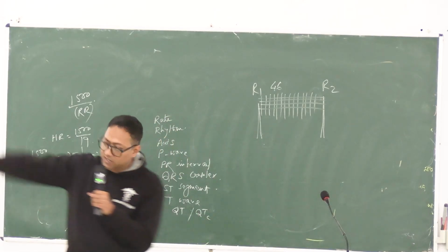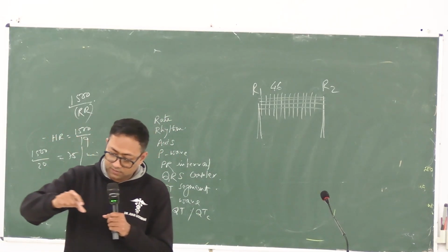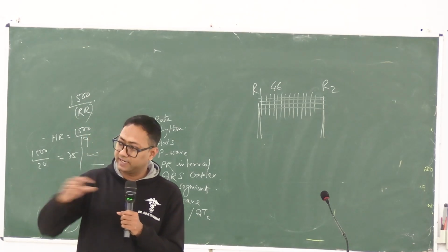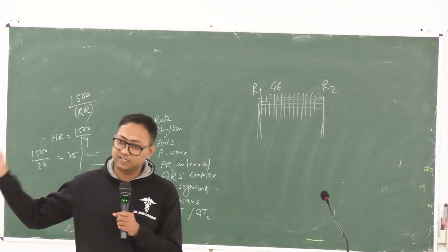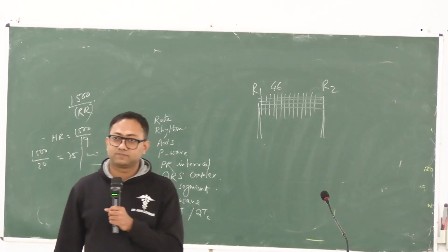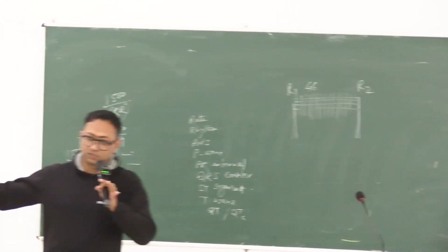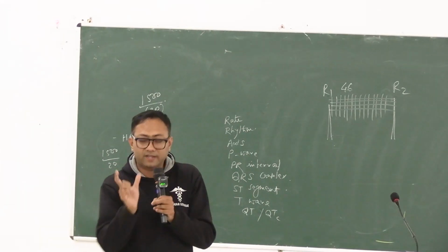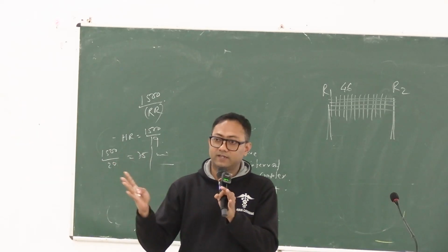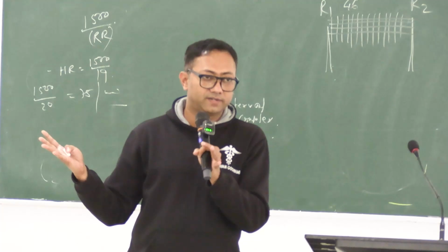Normally the paper is emitting at a certain speed, but if I increase the rate at which the paper exits the machine, R waves will be more spacious, because in the time between 2 beats the paper will emit more, so the space between 2 adjacent R waves will increase, right?